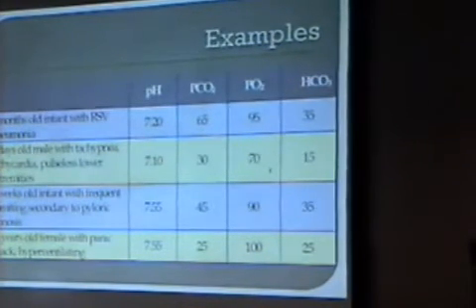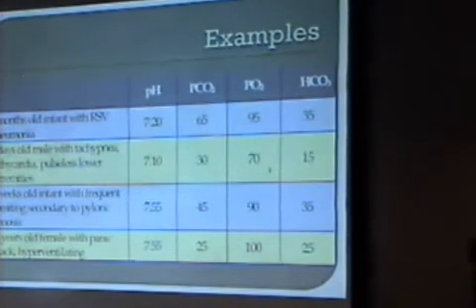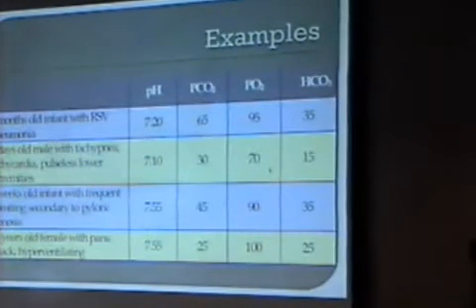Okay, respiratory acidosis. Is there compensation? Well, probably CO2 is a little too high. Okay, because this is basically pure respiratory acidosis. Forget the bicarb part. Because 65 CO2 will bring down your pH by 0.08, 0.08, 0.04. Correct? So together will be 0.2. So will be correct pH.